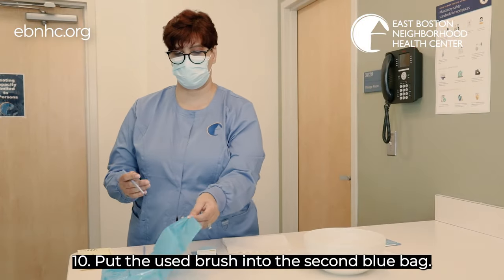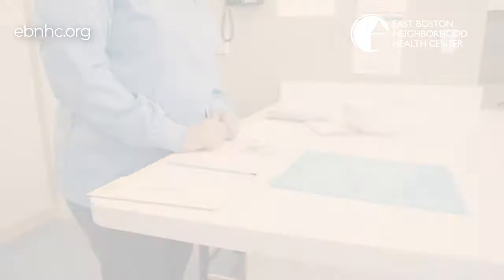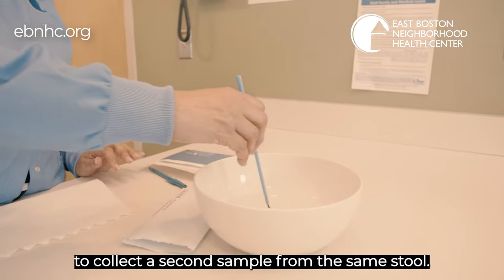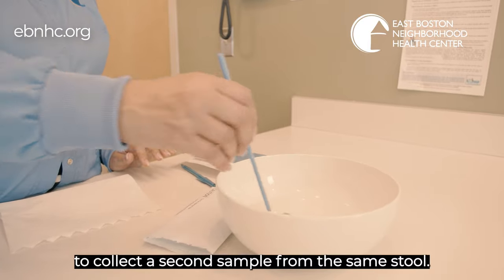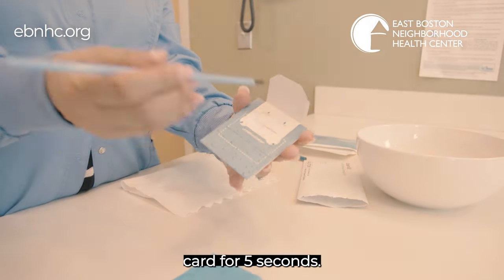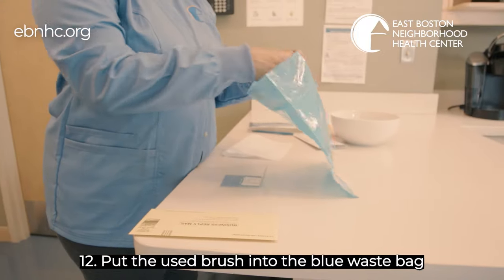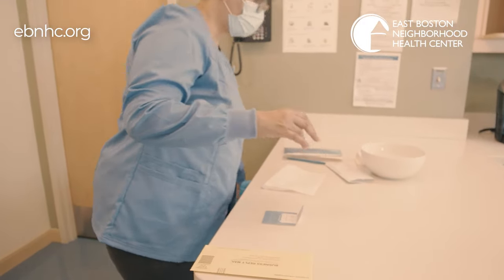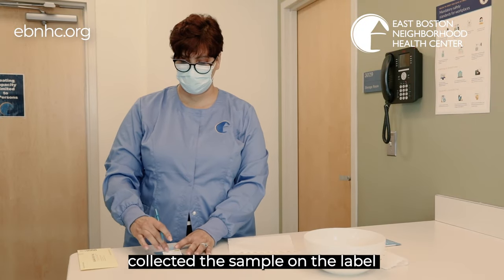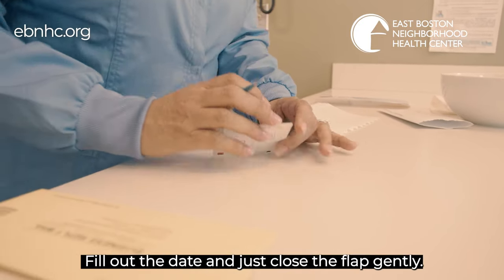Step 10: Put the used brush into the second blue bag. Step 11: Take the second brush and repeat the steps to collect a second sample from the same stool. Dab onto the second white square on the test card for five seconds. Step 12: Put the used brush into the blue waste bag and discard in the trash. Step 13: Don't forget to put the date you collected the sample on the label that is on the card. Fill out the date and close the flap gently.